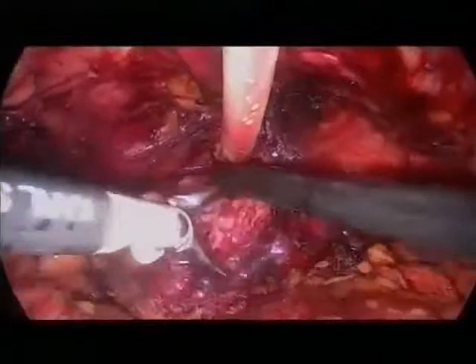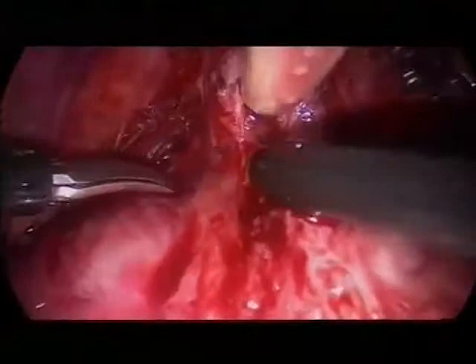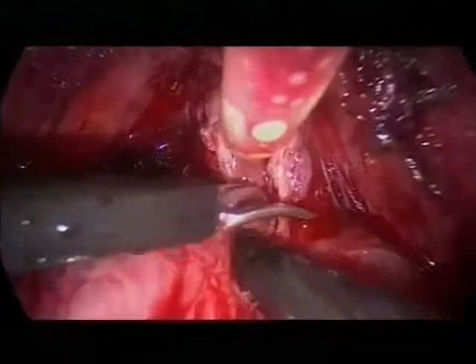Sometimes, and then cut directly behind. It depends on the patient. Sometimes the vero is deep inside the prostate. Here we are sure there's no injury of the capsule, you see that. And we cut here. But you have to see the urethral crest. But very often the veromontanum is deep inside the prostate. In this patient, it's here.